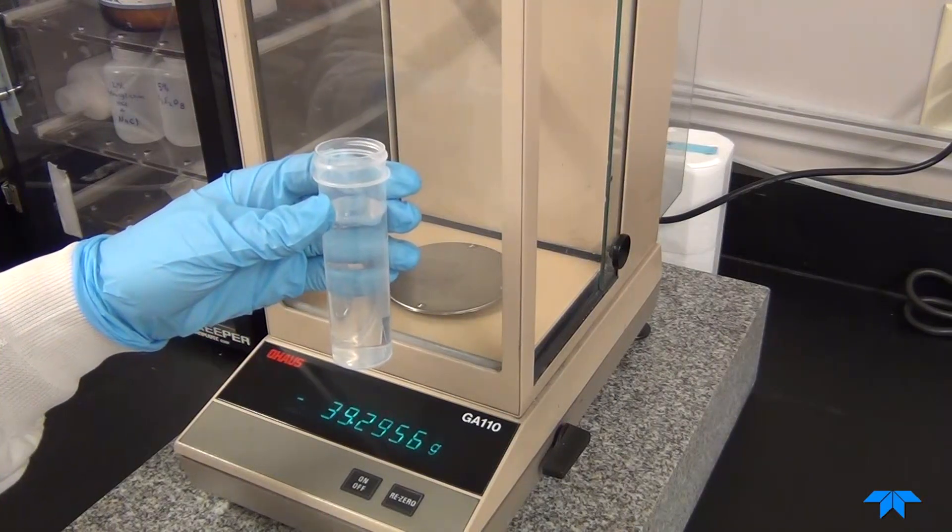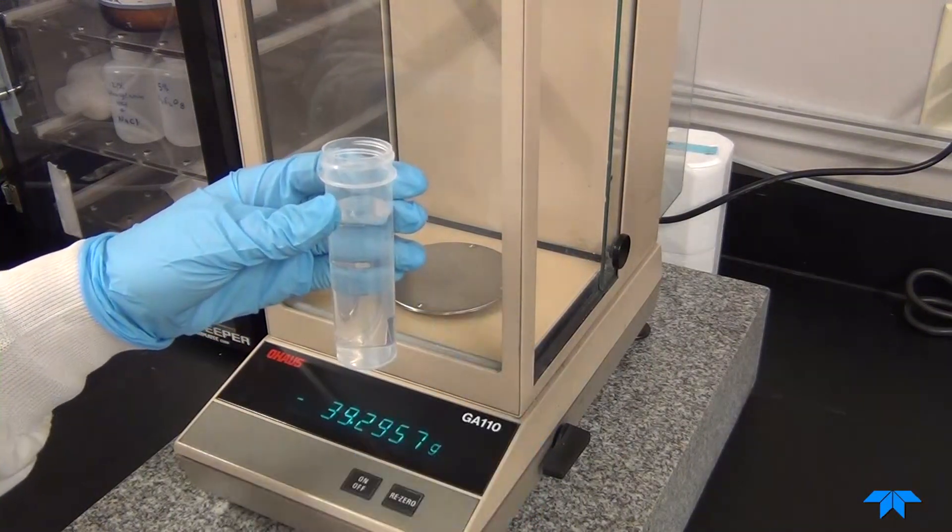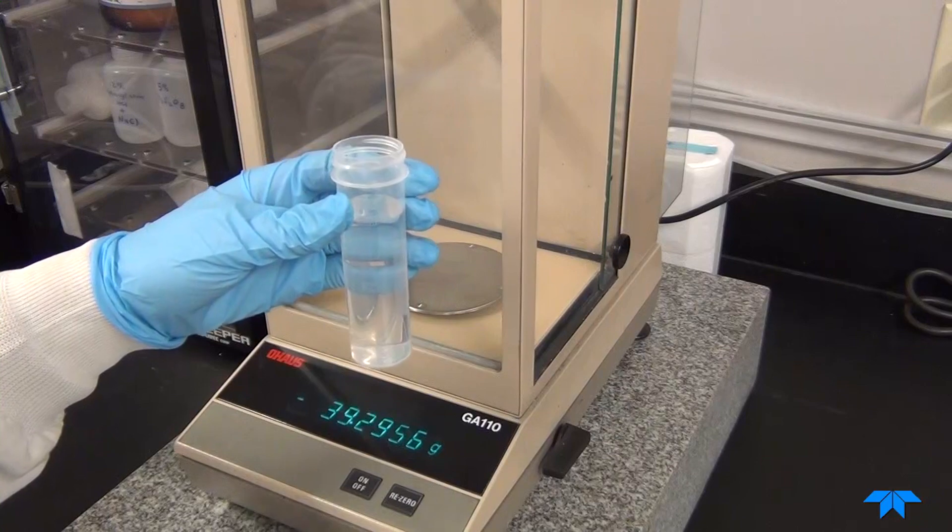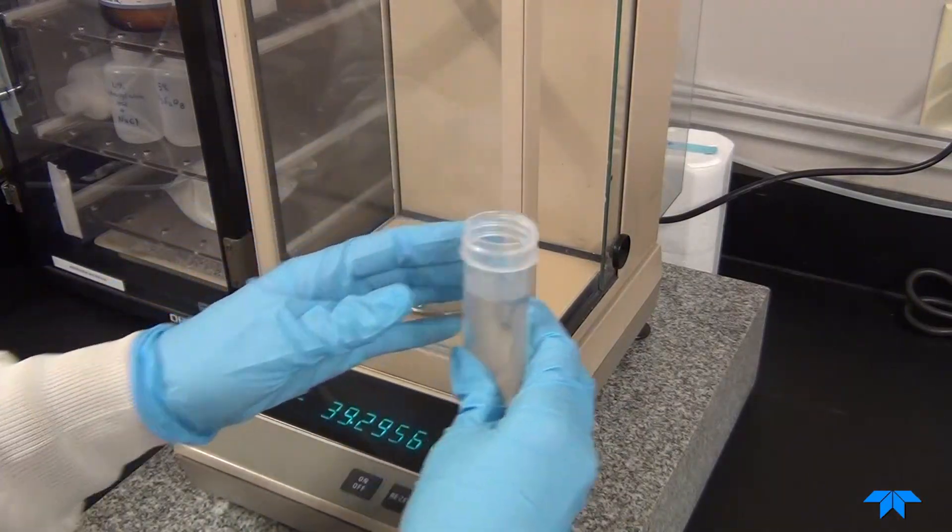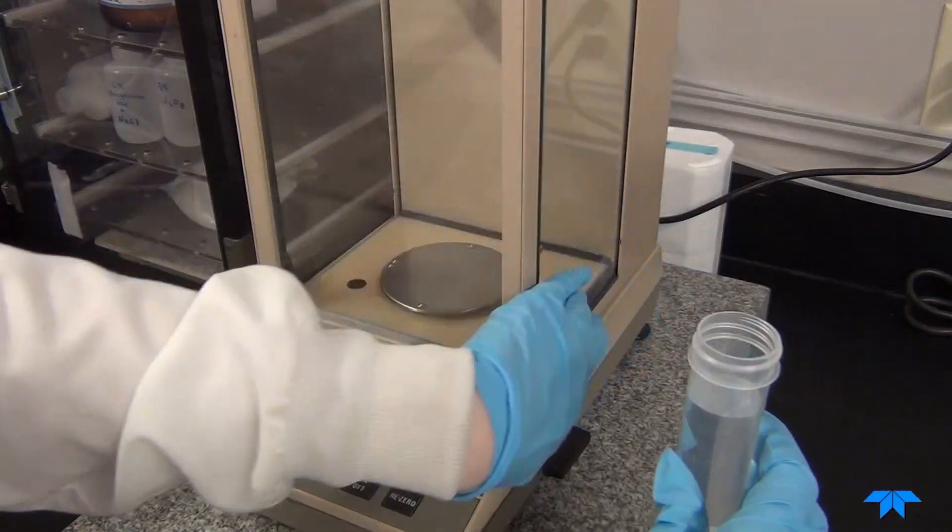Let's start with the stannous chloride reagent uptake. First we will need to fill a small sample tube or beaker with approximately 50 milliliters of DI water.